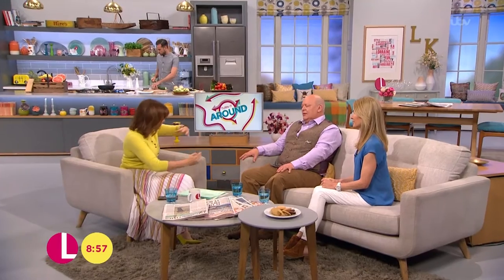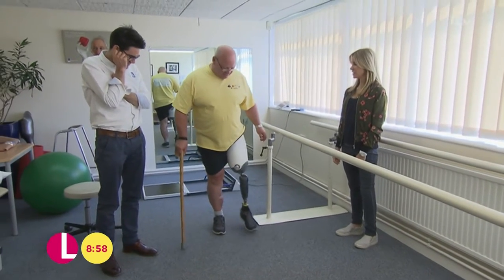Sean, this new leg which is still being worked on — it feels like part of you. It does, much more attached than the current one which sort of wallows around, so the moment it's on you just feel more in control. It's so important for learning to walk when you've got a better connection with your residual limb — you can step on it and it feels like part of you. At the beginning you're still quite swollen after the operation, so the socket has to be continually made smaller, and the better fit you have the more chance you've got of balancing and stepping forward. Matthew's creating an incredible bespoke socket on this super high-tech leg.